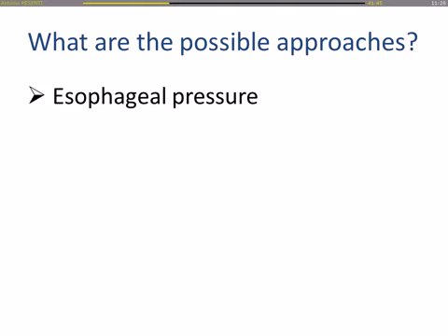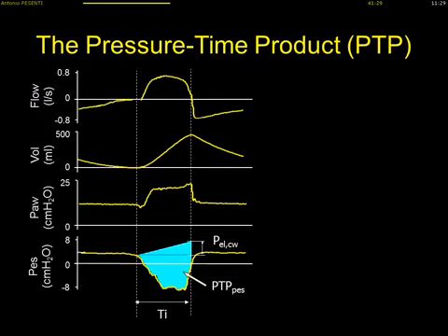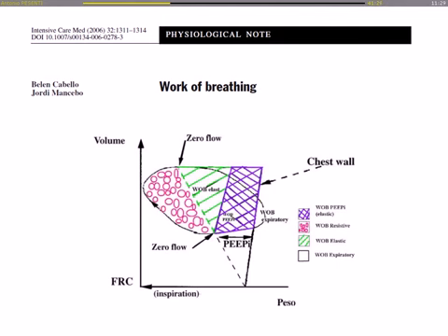But you can do it in a very complicated way using esophageal pressure. And you can even measure respiratory work. Measuring respiratory work is quite difficult. You need special tools. For the time being, respiratory work is a research tool. I show you this slide and I go ahead.